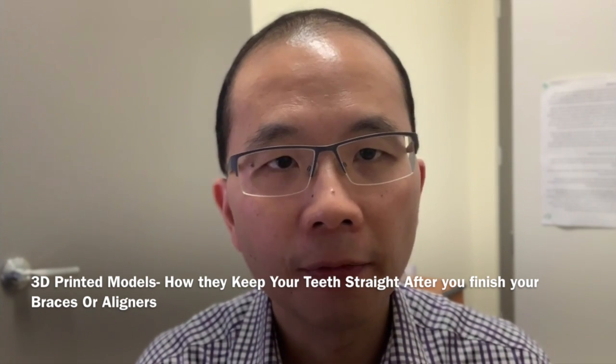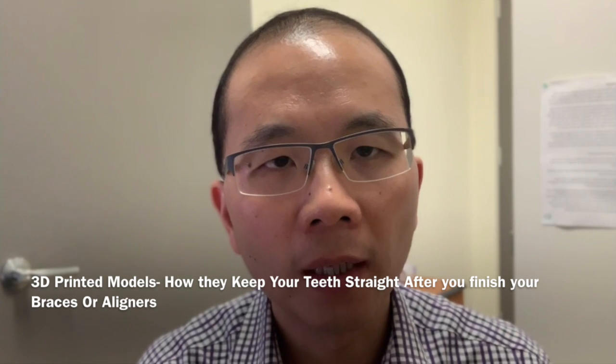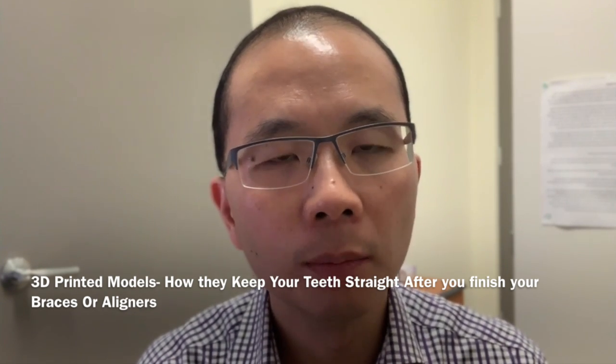What I wanted to share with you is what we used to do and what we have now moved towards with improvements in technology, and how these deliver better outcomes for you. Better outcomes in terms of helping to keep your teeth straight and maintaining straight teeth.